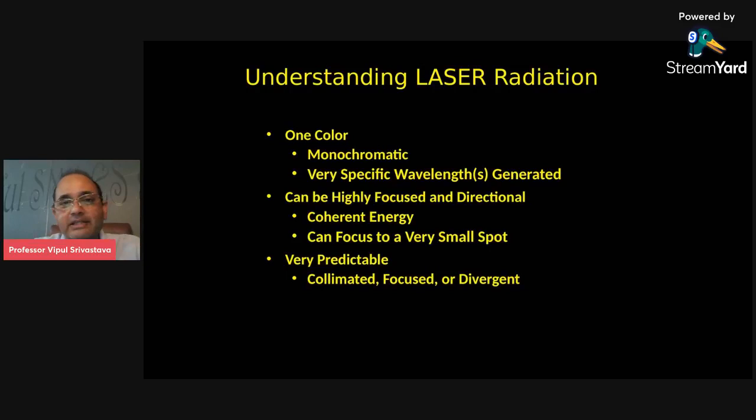What about laser lights? Like I just mentioned, they are monochromatic, with a very specific wavelength. Very specific wavelength means they can be 450 nanometer if they are blue in color. Then we have near infrared: we have 810, we have 940, we have 980, we have 1064. These four are diode laser wavelengths. Besides this, 1064 is a wavelength for Nd:YAG also.